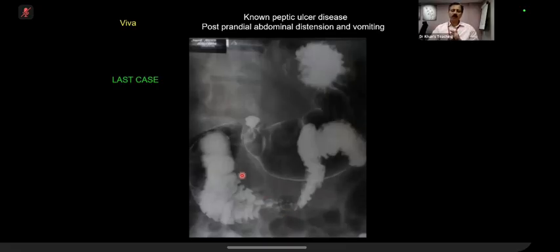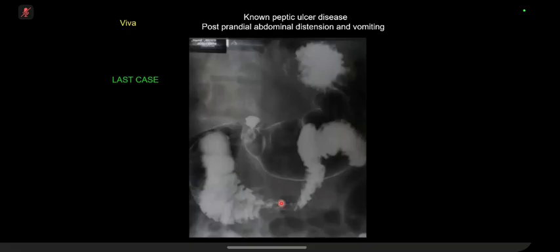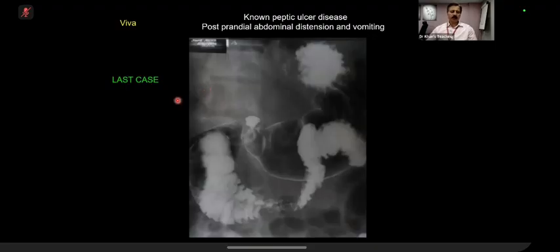Go to anatomy. Okay. And go to vascular anatomy. Here. Sir, compression syndrome, sir, superior mesenteric vessels show compression. Excellent. Syndrome. Okay. Well done. Well done. You can mute yourself.